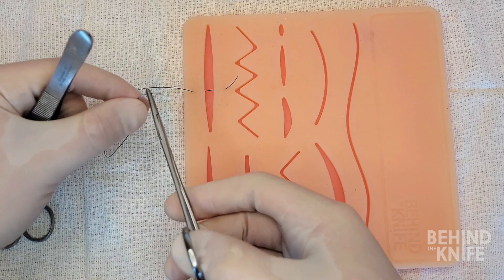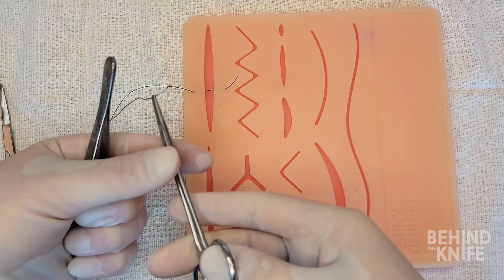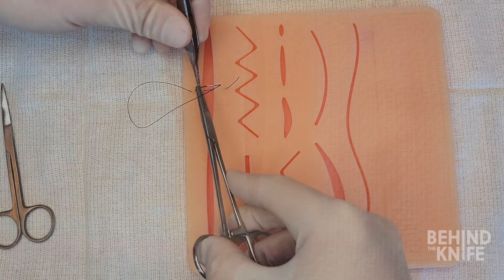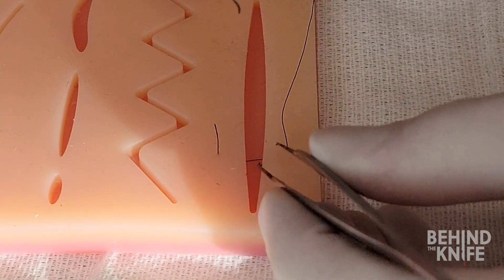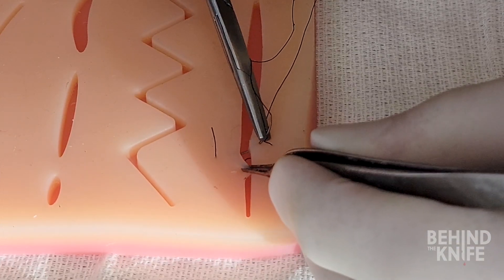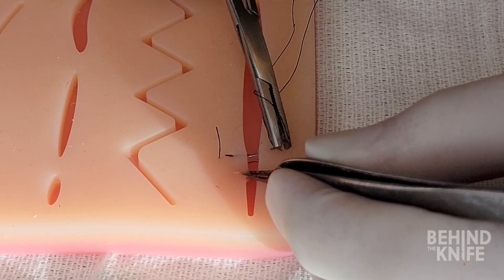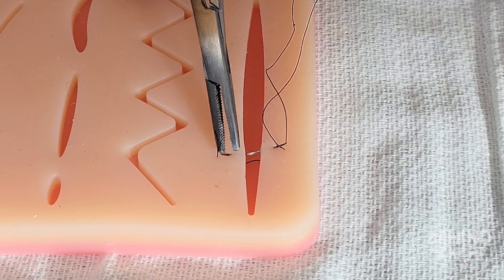For the near-near portion of the suture, the needle will need to be in the needle drivers in the orientation for a backhand throw. We're going to enter the skin within one to two millimeters of the wound edge, and this will be superficial where the needle should stay in the upper part of the dermis. This throw is easier to take in one bite, so it'll come out on the other side of the wound within one to two millimeters of that wound edge.